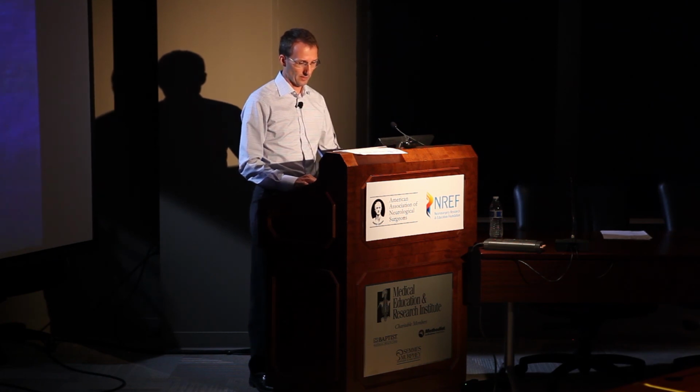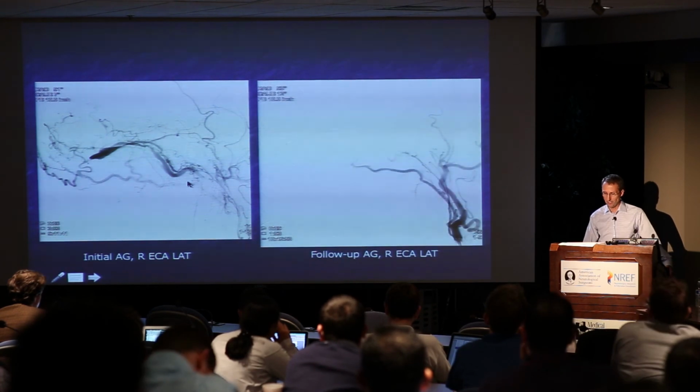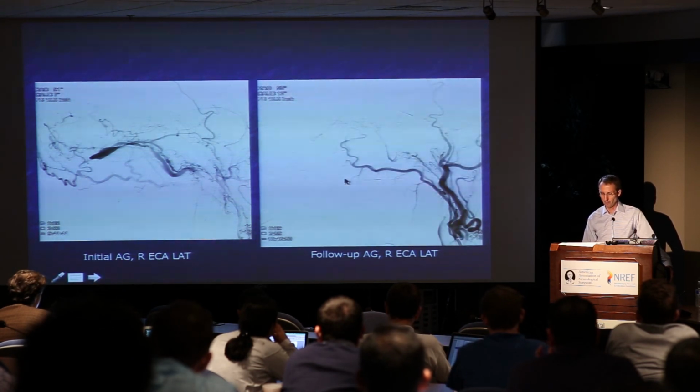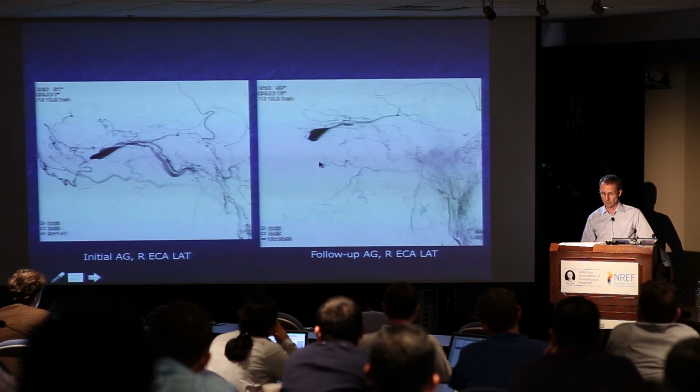This was the initial angiogram, just again to remind you of the anatomy. And when we did our follow-up angiogram, which again I think was about a month after his initial surgery, this is sort of what we saw. So the fistula is still filling, ascending pharyngeal, occipital arteries coming up. Here's the fistula pouch running through here. As we go forward, though, you'll see something has changed.